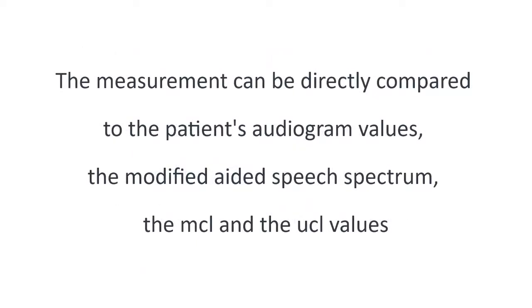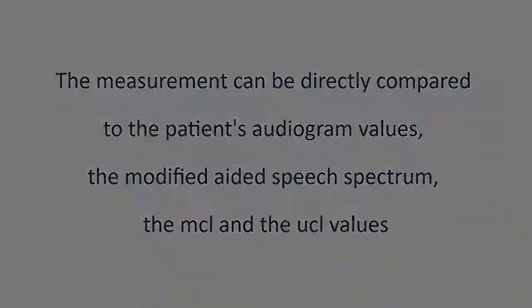The measurement can be directly compared to the patient's audiogram values, the modified aided speech spectrum, the MCL, and the UCL values.